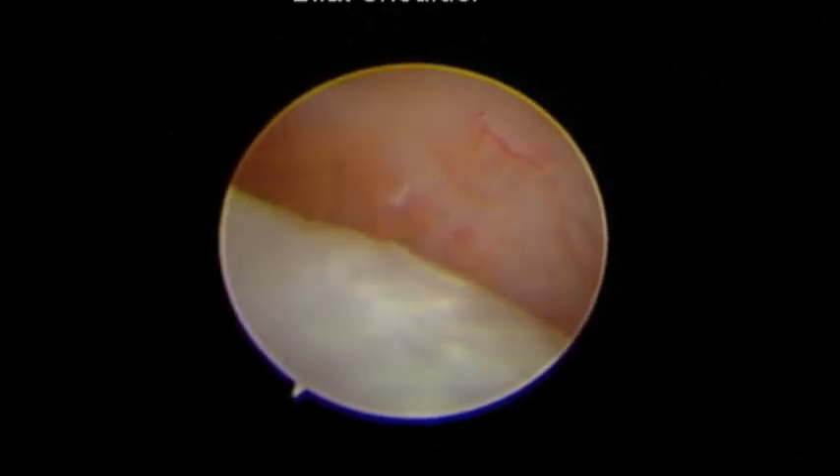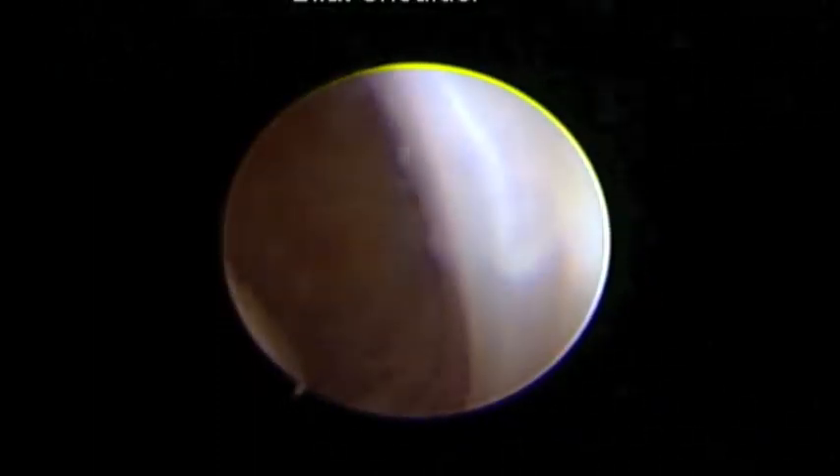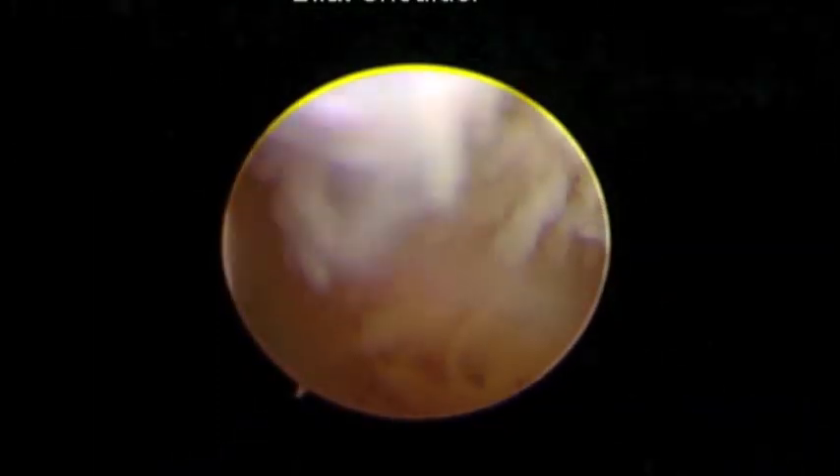Without a doubt, this is the worst shoulder I've ever seen in a border collie in my entire life. From top to bottom, front to back, there was pathology everywhere. I'm not quite sure what was keeping this shoulder joint in the socket.